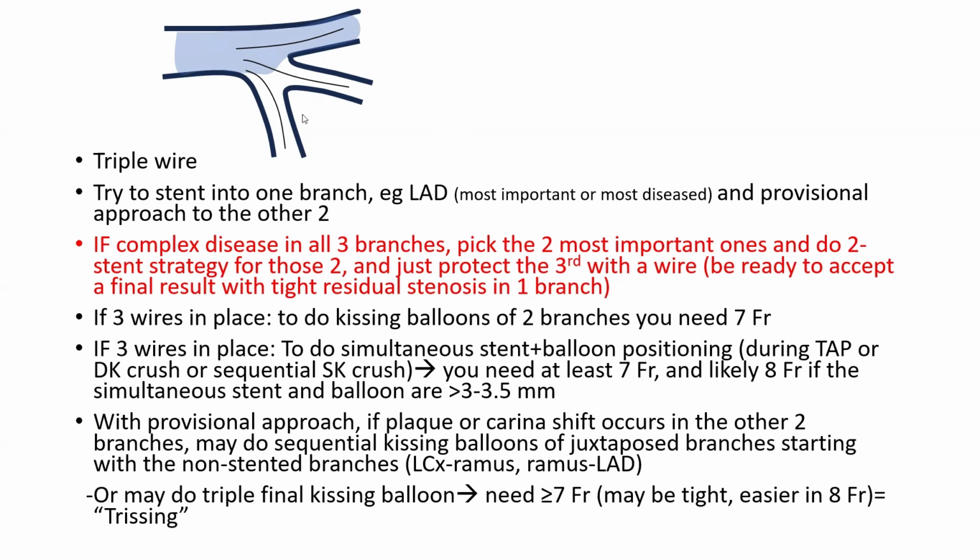Sequential kissing balloon of juxtaposed branches finishing with the branch that is stented, the left main LAD.